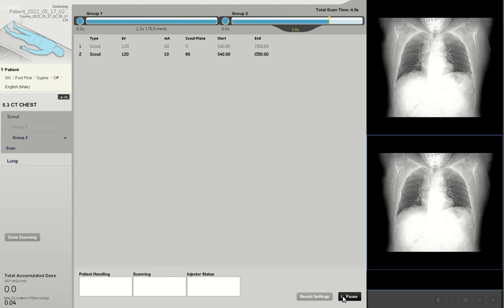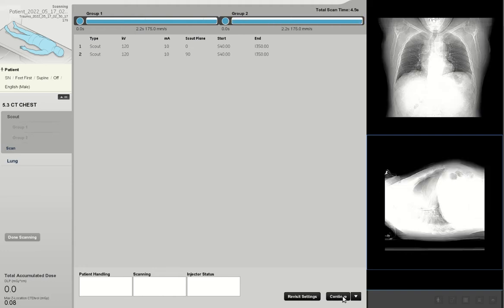Taking into account auto positioning in the in-room camera, scout images are acquired which optimally position the patient within the gantry, as viewed by the green line and check mark on the lateral scout image.